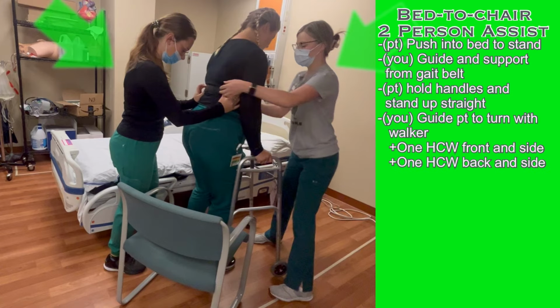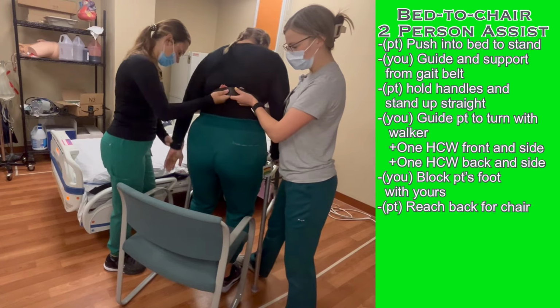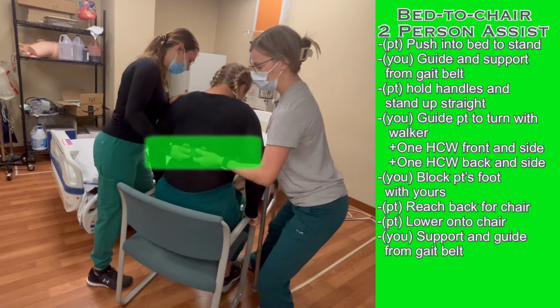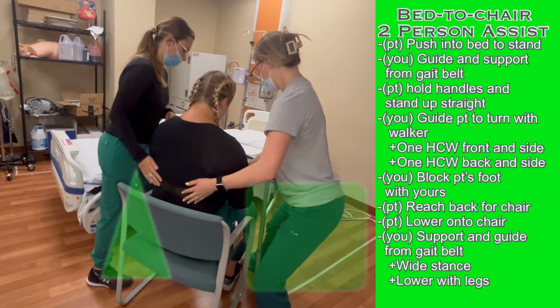When the patient is positioned in front of the chair, at least one healthcare worker should stand with their foot in front of one of the patient's feet to stop it from sliding. Have the patient reach back to the chair and begin to sit, while the two of you guide the patient from the gait belt. Stand with a wide base of support, and as you guide the patient down, lower the patient by primarily using your legs, not your arms and back.